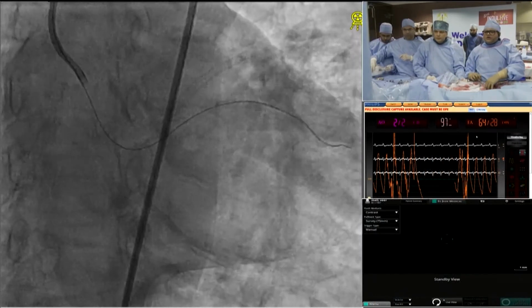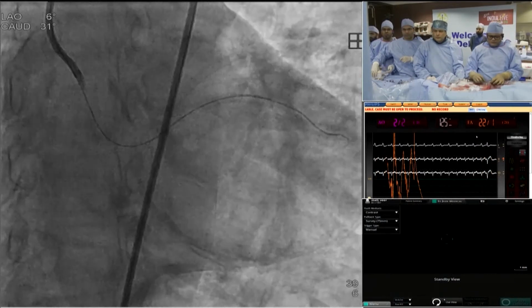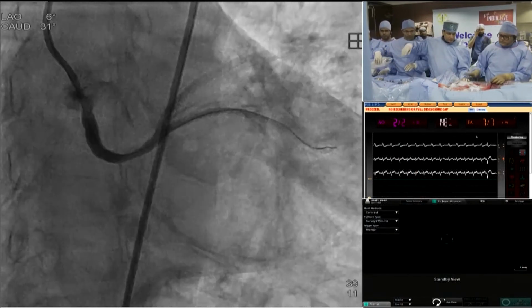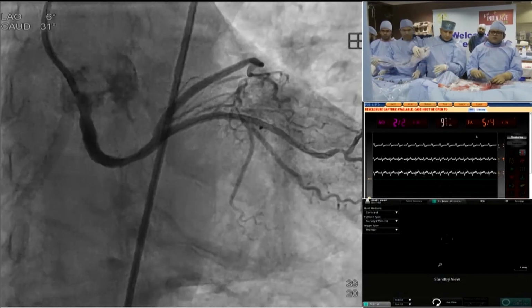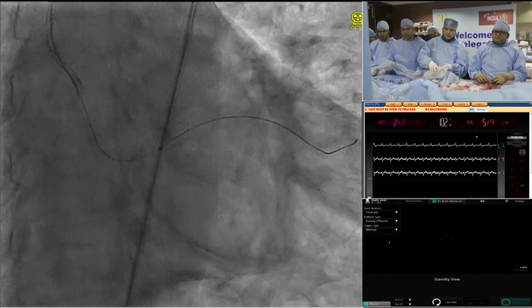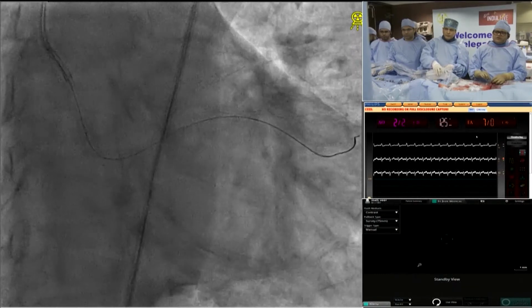So this is what it looks like proximally. Yeah, this is fine. But let's get the OCT catheter in and see. Yeah, it looks more reassuring in this view. That's right. We're feeling better. But Dr. Sharma still wants that circumflex post-dilated. It looks like in the middle segment, slightly underdone angiographically.